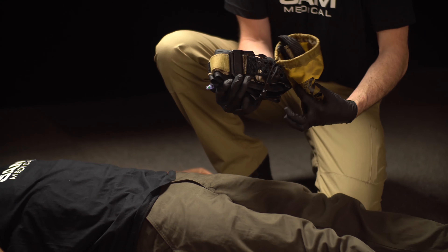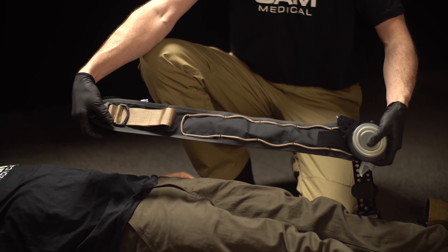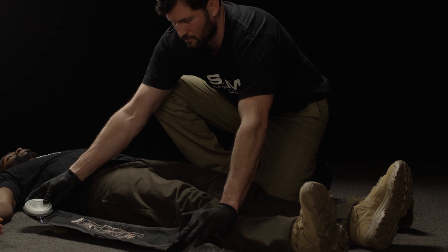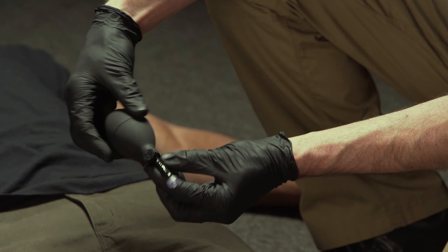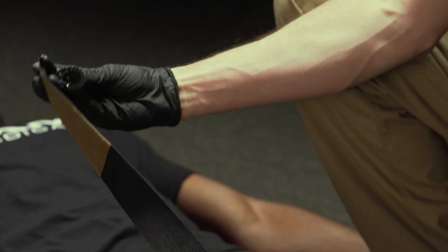A ruggedized belt that leverages patented SAM AutoStop buckle technology, an inflatable target compression device or TCD, a second TCD with an attached extender, a hand pump to inflate the TCDs, and an auxiliary strap to control junctional bleeds of the upper extremity.